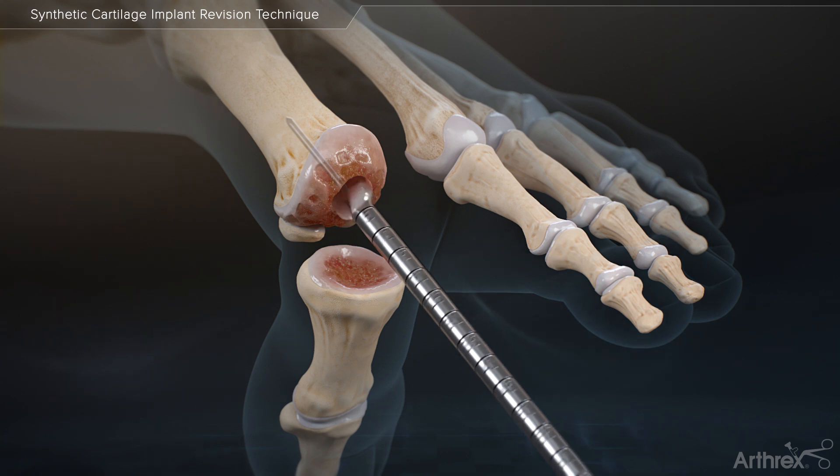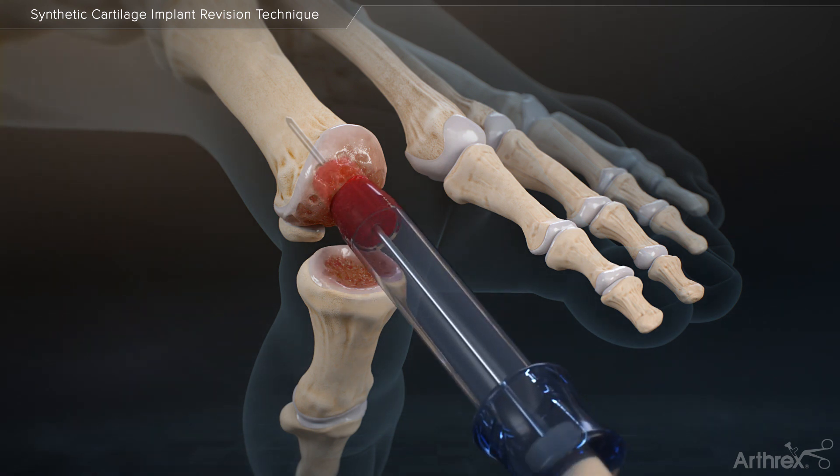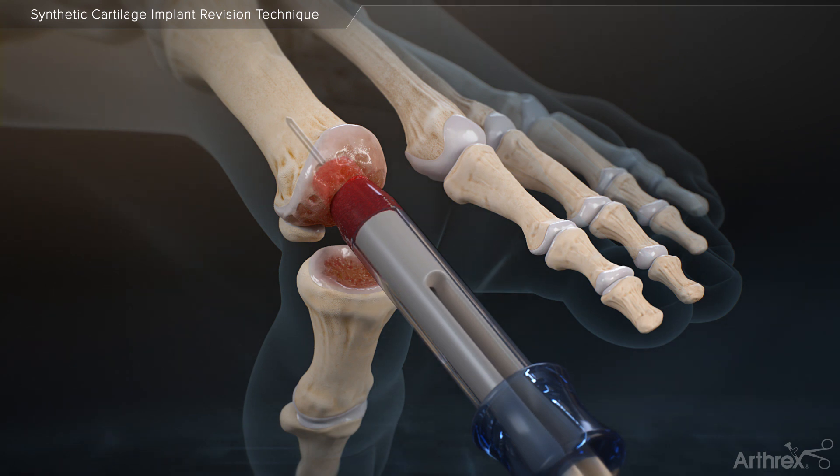It is recommended to drill at least 5 mm past the original length drilled for the Carteva implant. The cannulated bone dowel is then placed over the guide wire and tamped into place using the cannulated bone tamp and optional graft delivery tube.